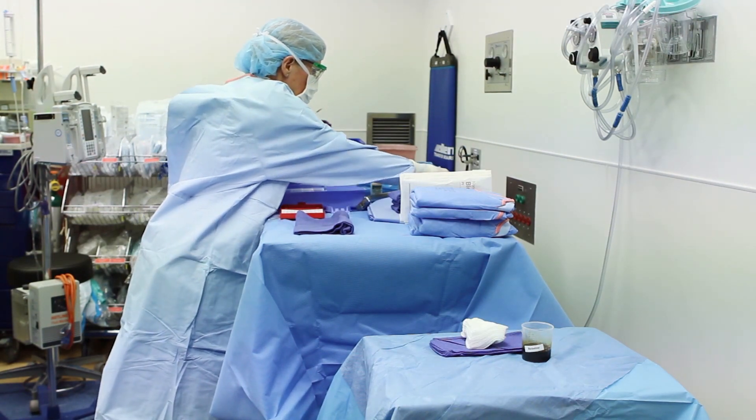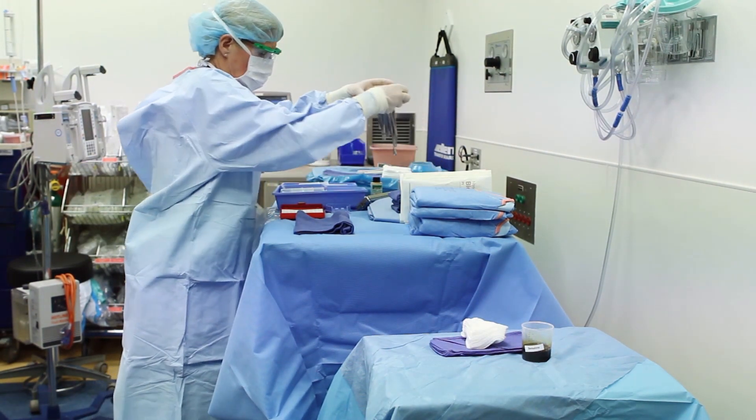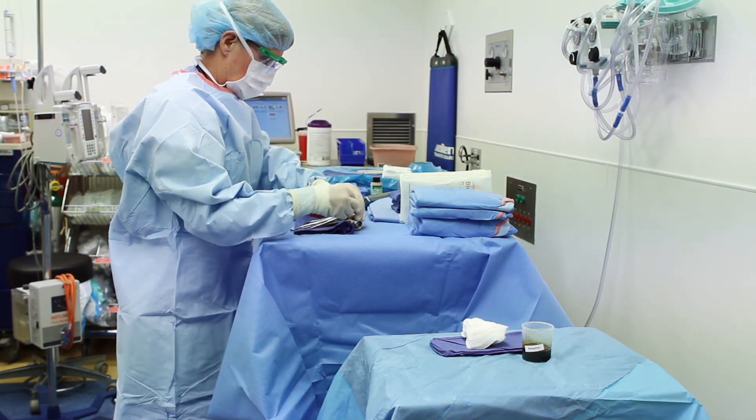A Mayo stand is prepped so that surgical instruments that are more frequently needed are placed nearest to the patient.